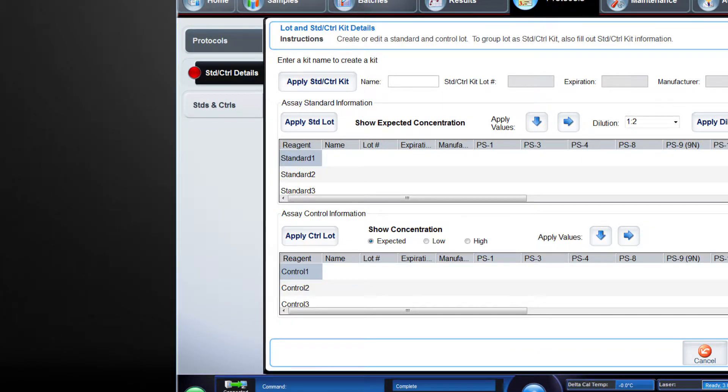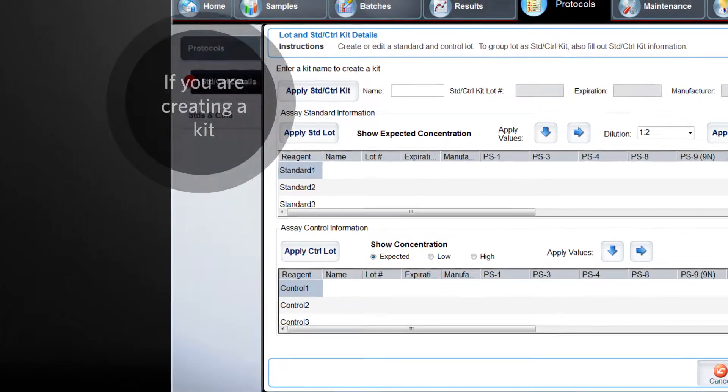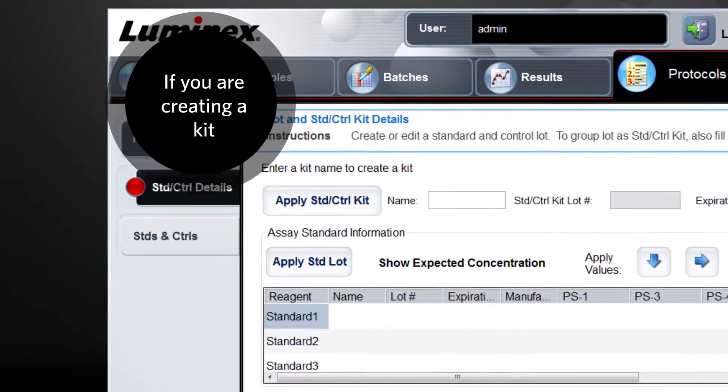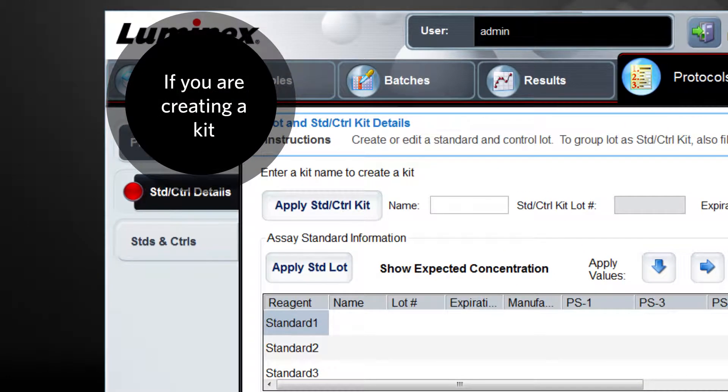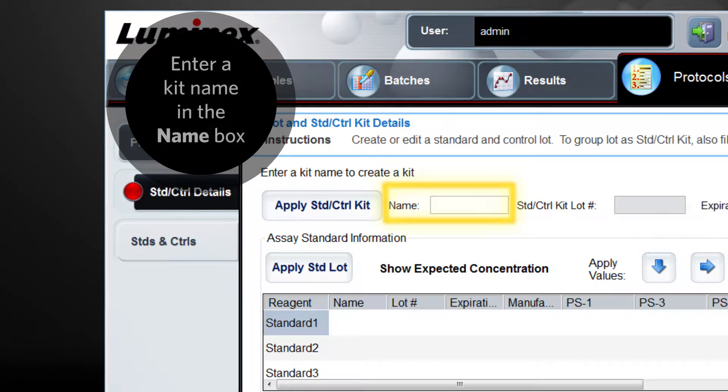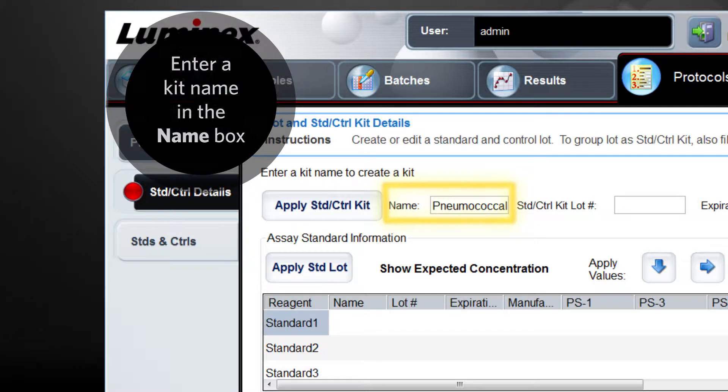Next, you will enter information about the standards and controls. If you are creating a standards and control kit, start by entering a kit name in the name box under the enter a kit name to create a kit section.